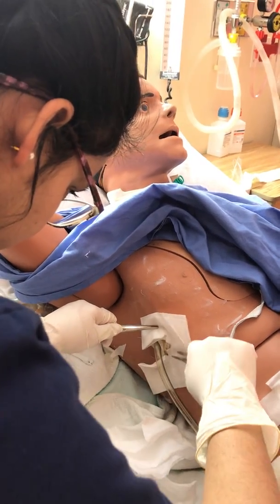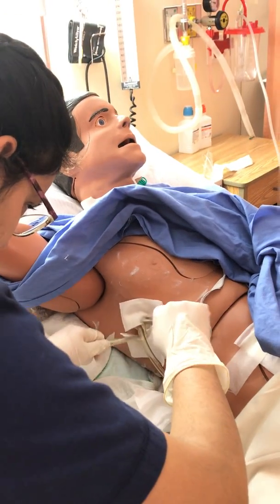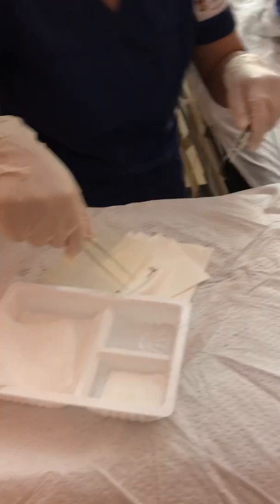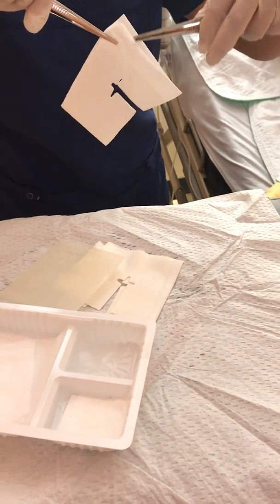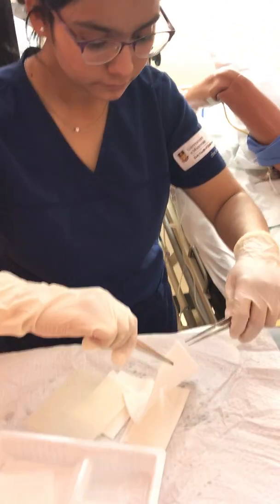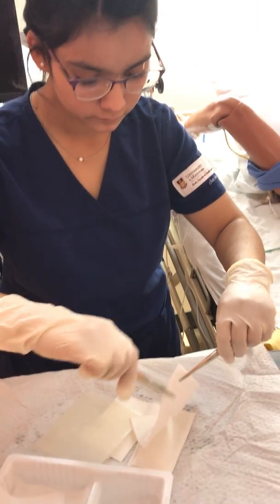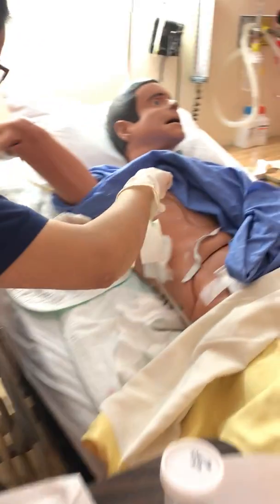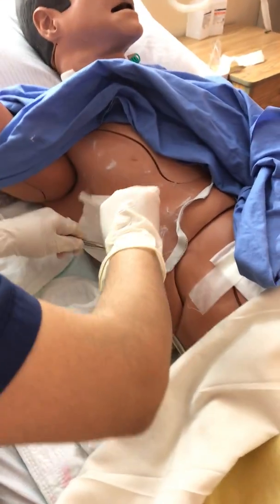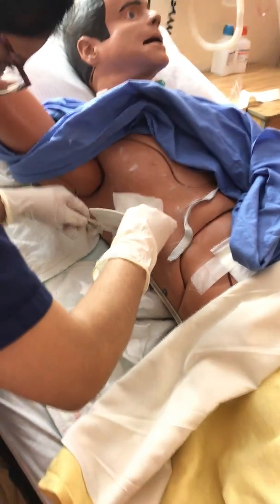While we're cleaning the stoma site, I'm going to clean for 30 seconds. There we go. So now we're going to take another one. Now I'm going to dry the site. 30 seconds. Let it dry for 15. So now that it's done, we're going to do this in a different angle. I touched the tip of that, so I'm going to clean it again.